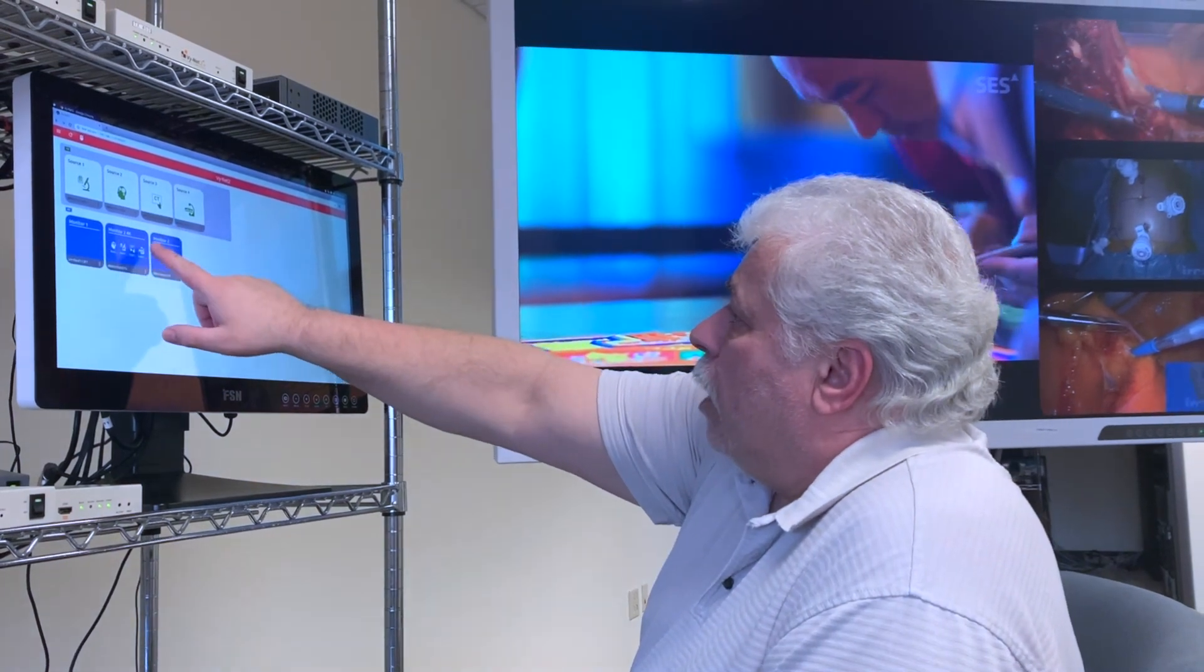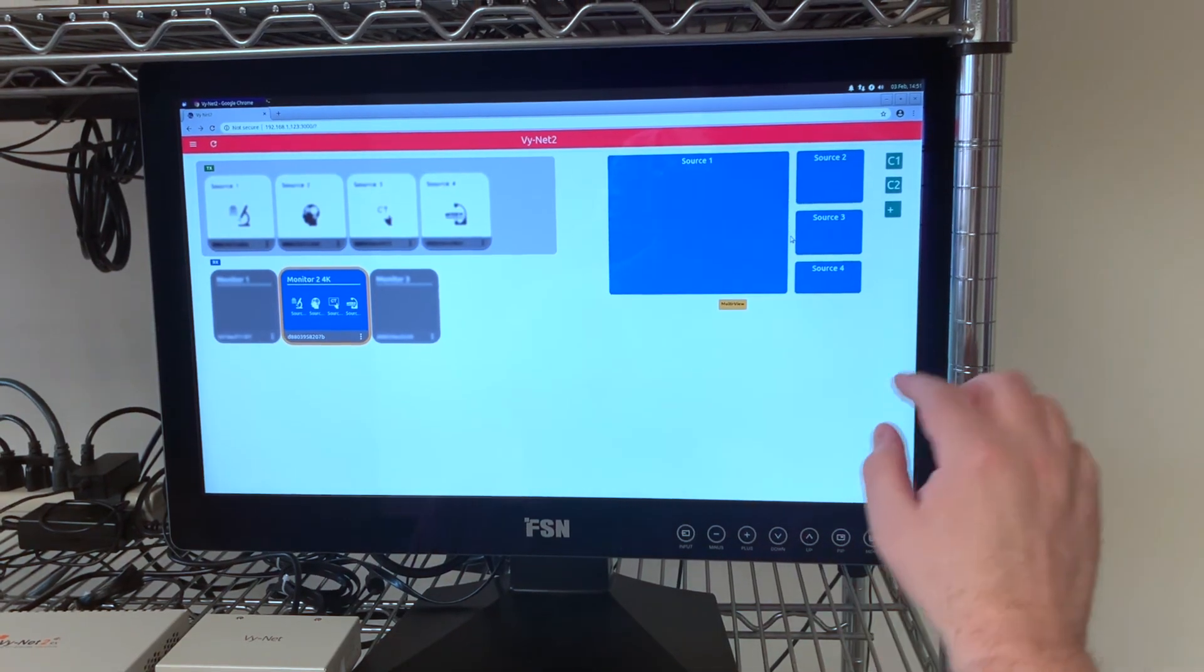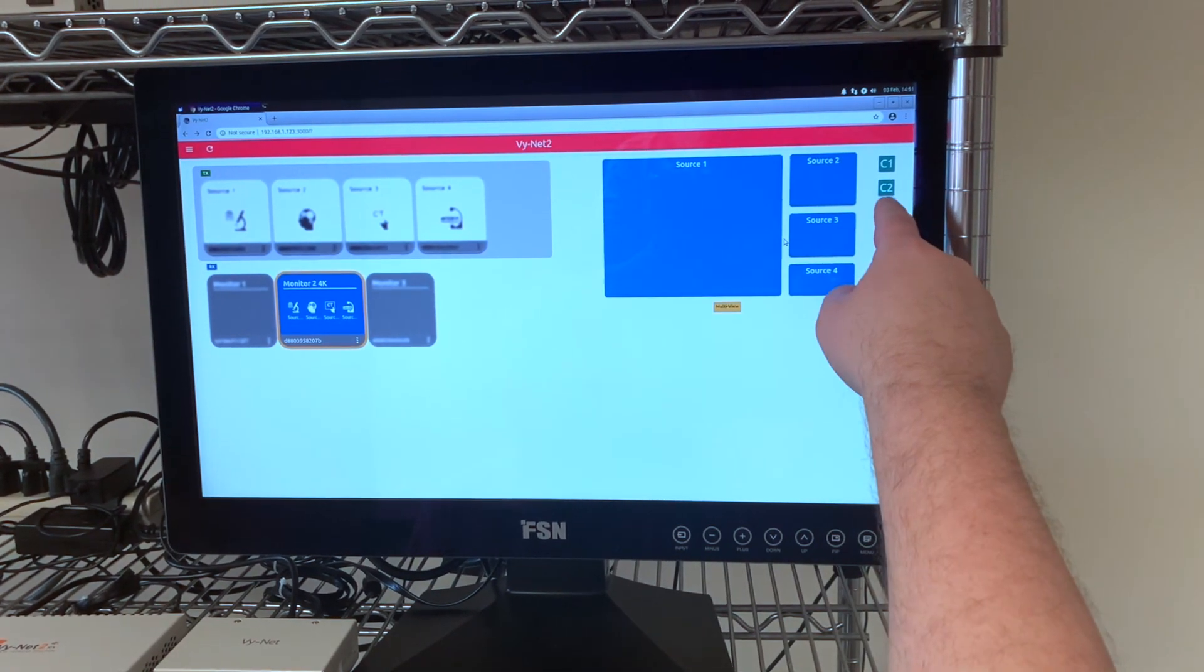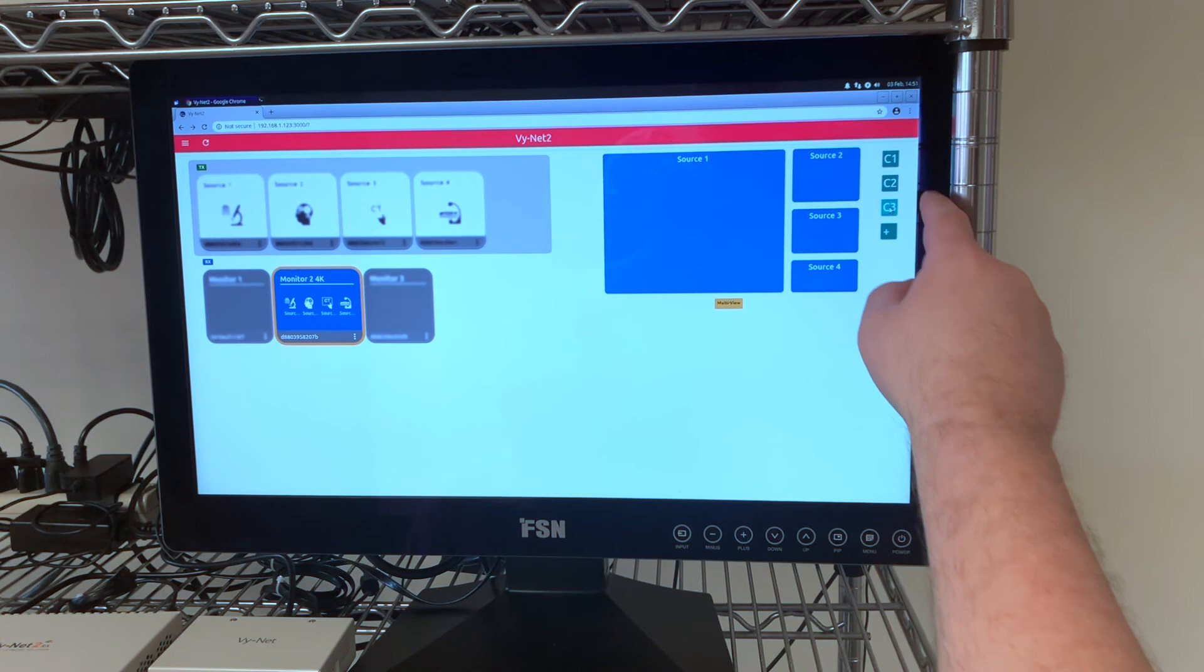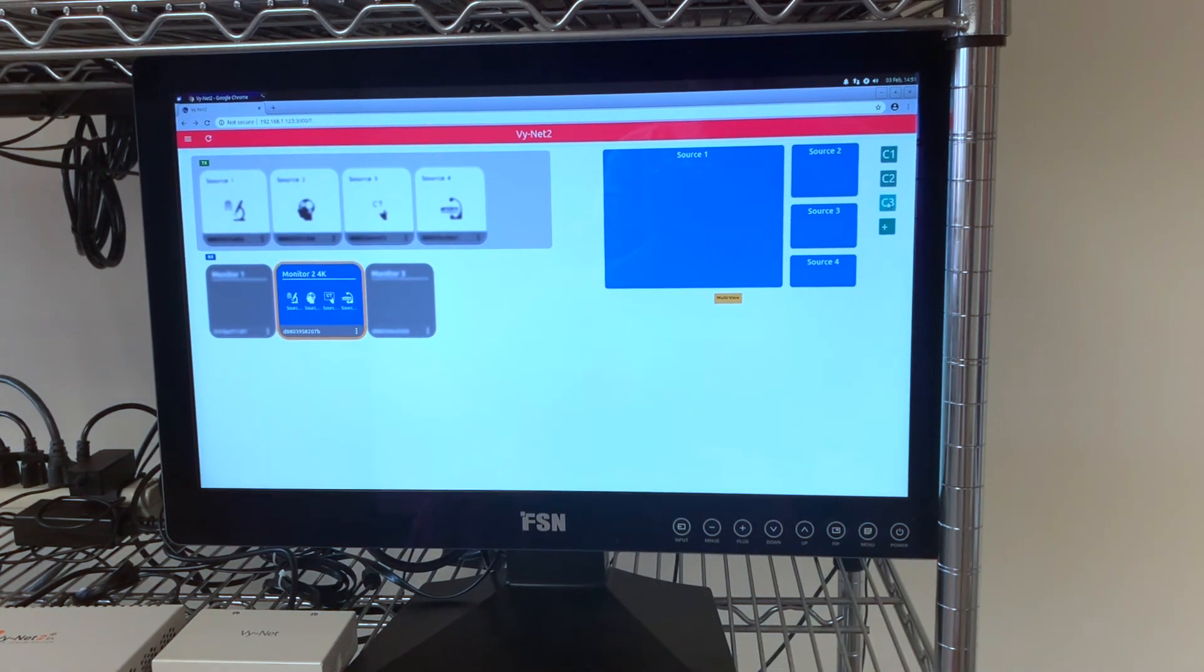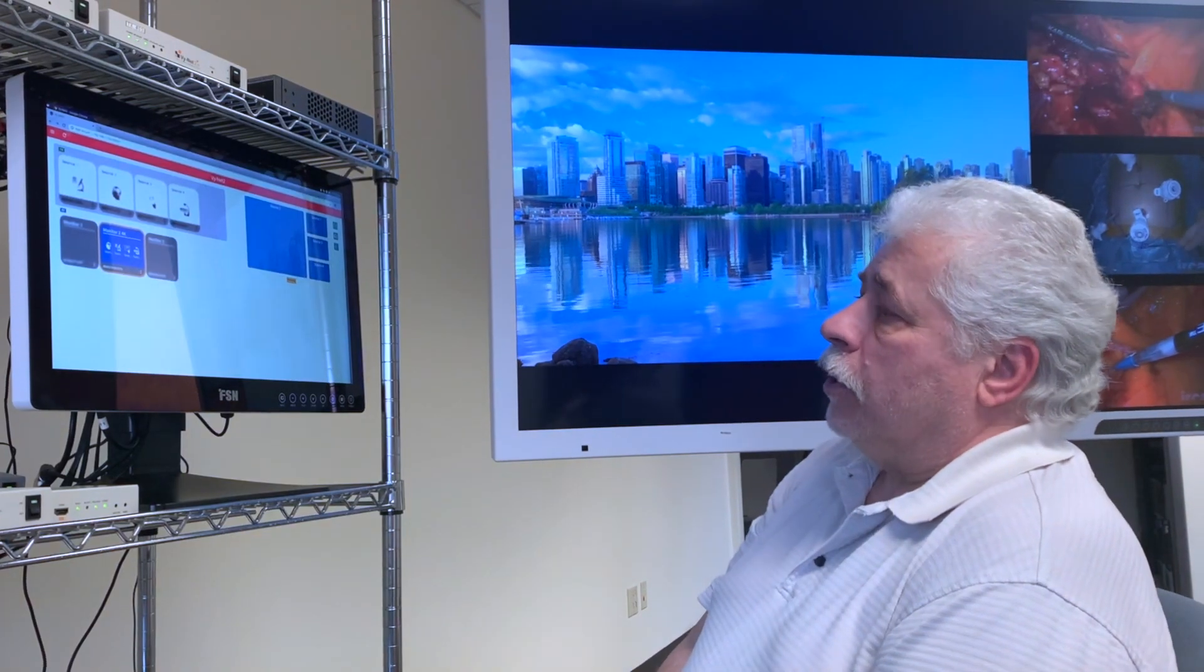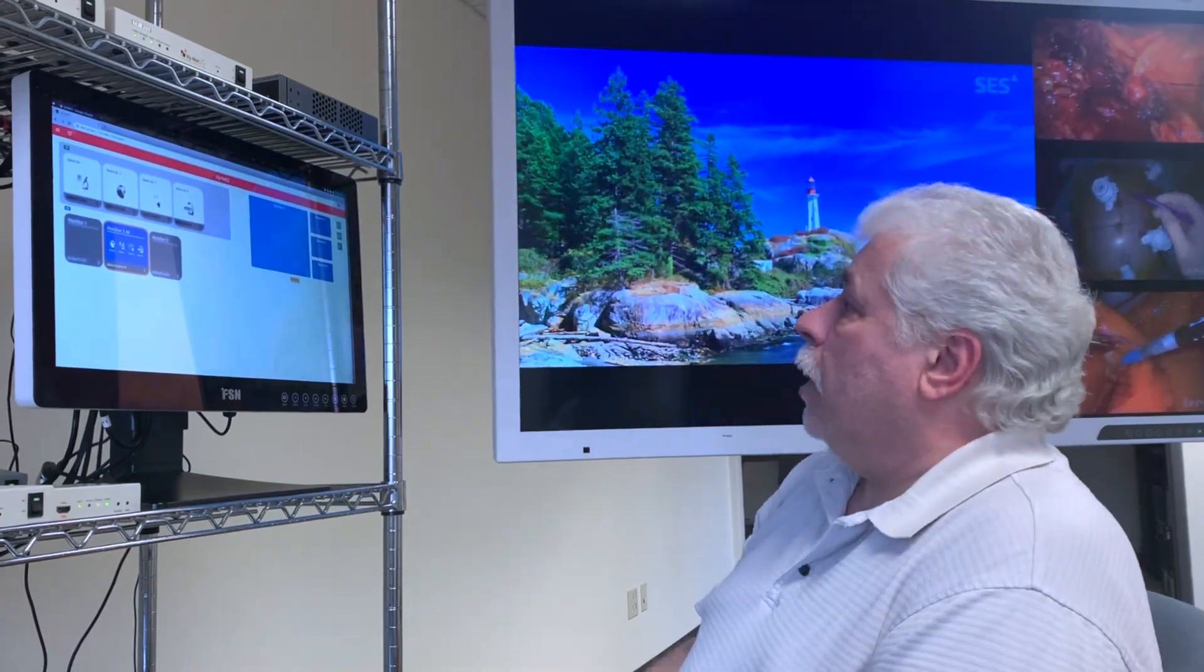Once I have my layout set to where I want it, then I can save it just by pressing the plus button. Now I can recall that layout at any time.